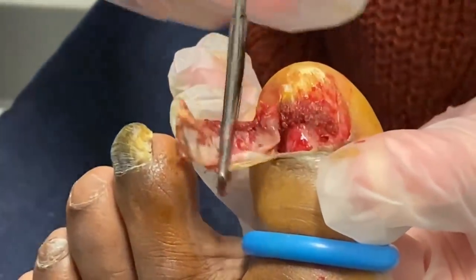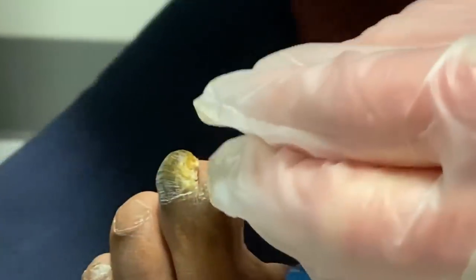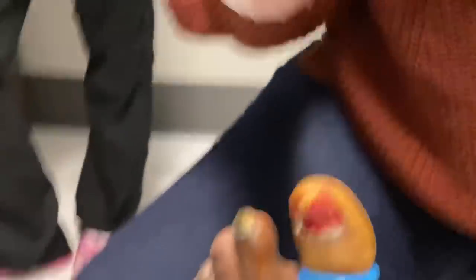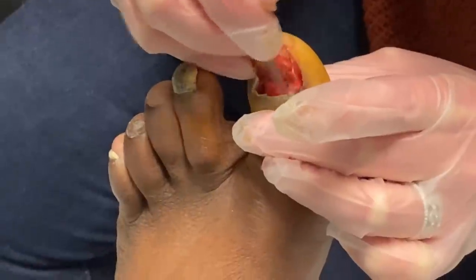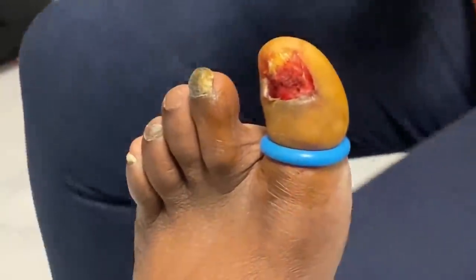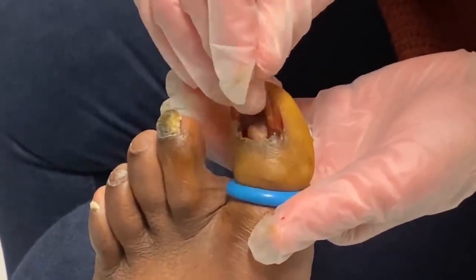Do you want to name it? All right, one second — I'm going to cut this out right there. You can call it whatever you want. Do you want to see it? All finished. And then we're going to make sure we didn't leave any nail root here. That's what happened last time. Usually if you take the whole thing off, you don't. But we'll get this root burned so it doesn't come back. I'm just going to really get at this since you had trouble with it coming back last time.